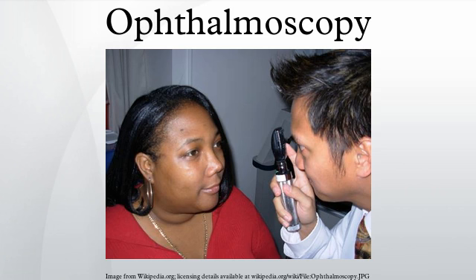Types. It is of two major types: direct ophthalmoscopy, one that produces an upright, or unreversed, image of approximately 15 times magnification. Indirect ophthalmoscopy, one that produces an inverted, or reversed, direct image of 2 to 5 times magnification. Each type of ophthalmoscopy has a special type of ophthalmoscope.